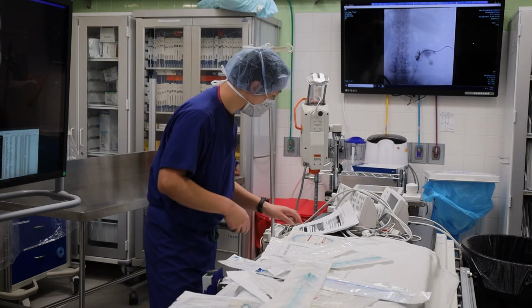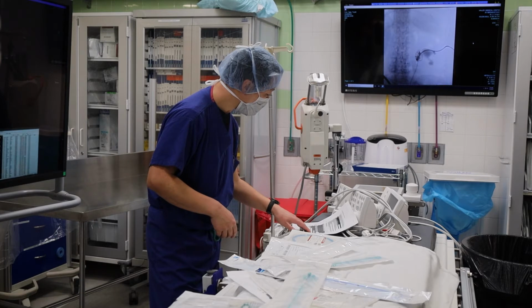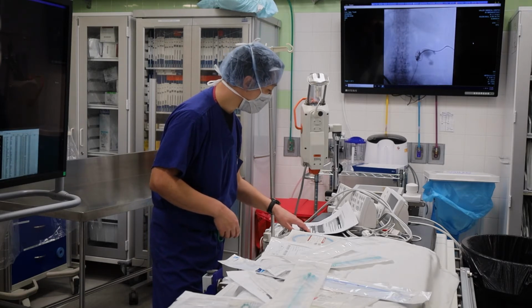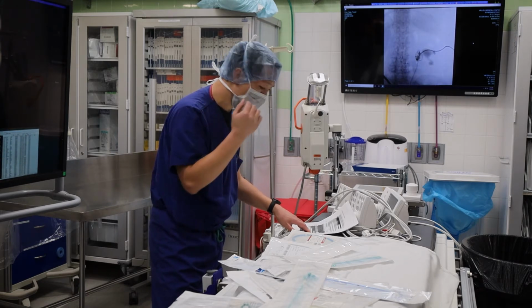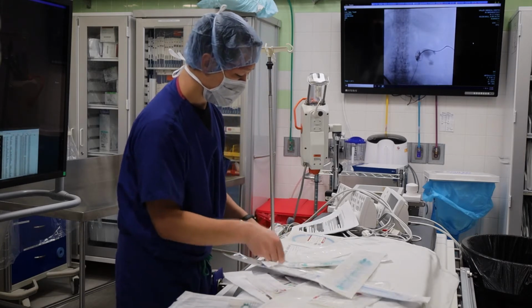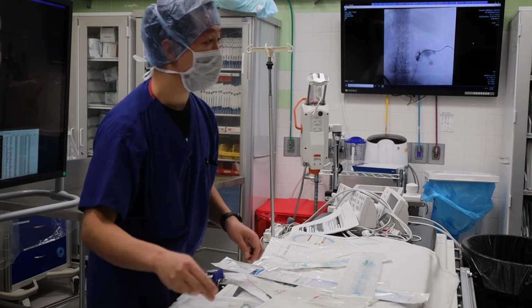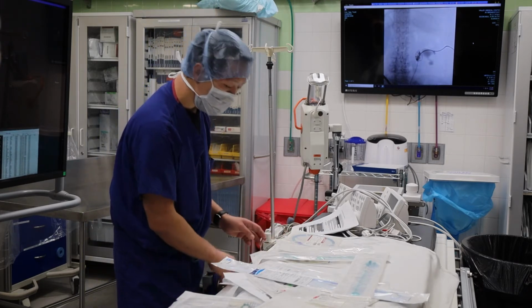Any questions so far? So you're saying we should ask the doctor about the 3-way or the 1-way that comes with the tubing? Yes. Hey, do you want it? Yes, no? Okay. I also have a comment about the one-way that comes with the tubing. There's a one-way that comes in our pack, and the lumen for the one-way in our pack is smaller than the one that comes with the tubing, so make sure you don't mix them up because you want free flowing as much as possible.